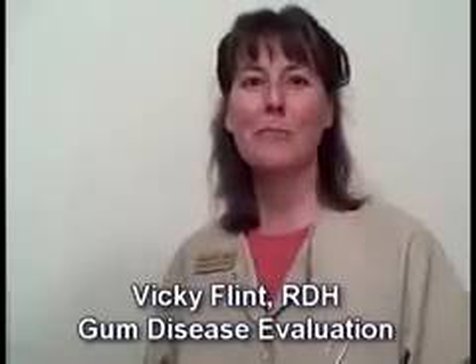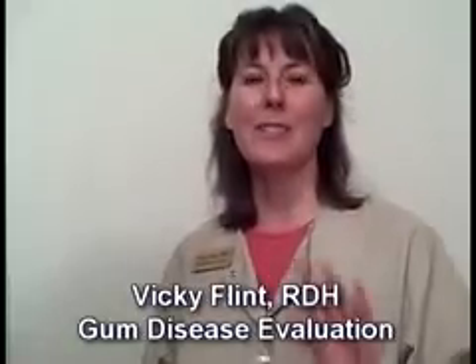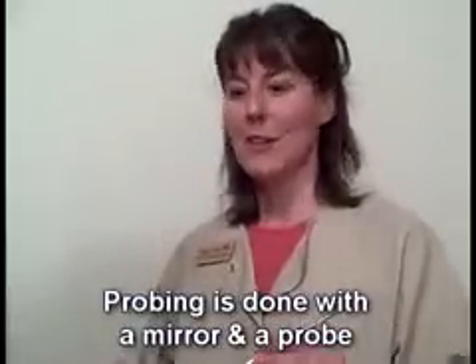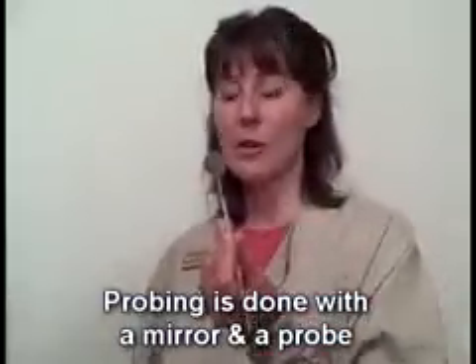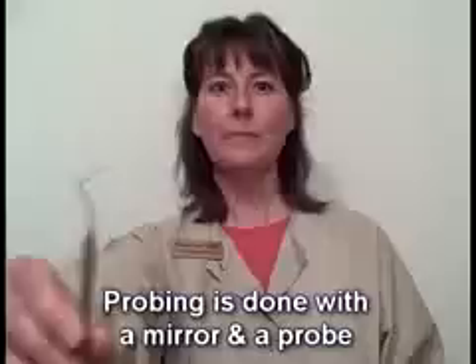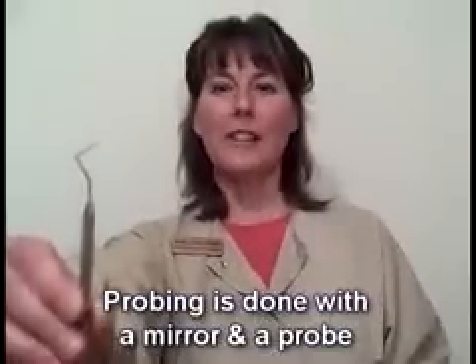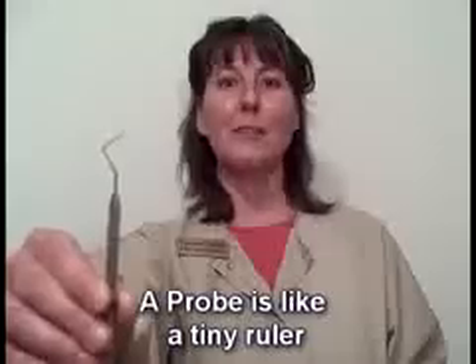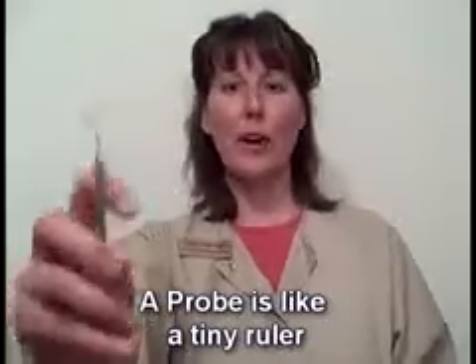Today I'm going to talk to you about what happens in a gum disease evaluation. It's called probing, and the instrument that I use first is the mirror, and also this, which is a probe. You can think of it as a tiny little ruler, and now I'm going to show you how it works.